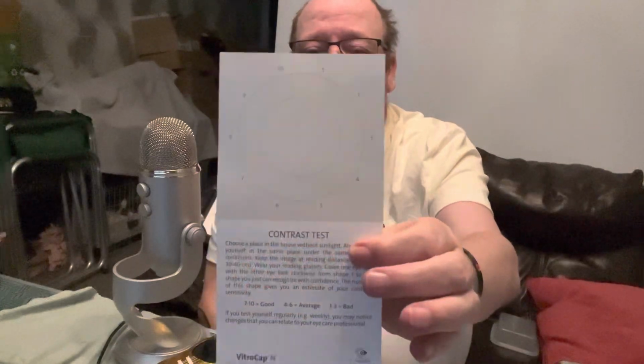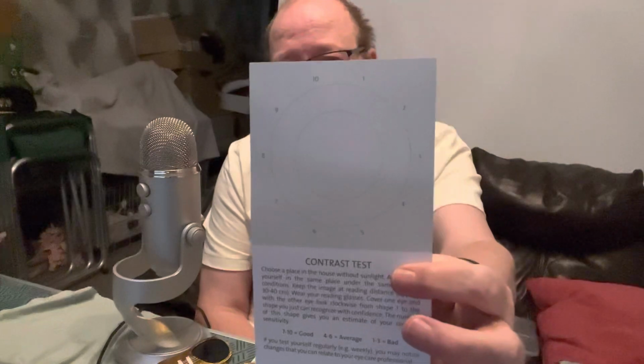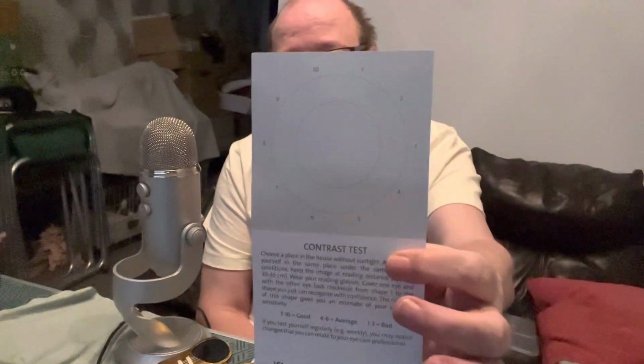There is also a contrast test. Now the contrast test has different shapes by each number, and the aim is that, again, you would be looking at that and mentioning what you see. So I would say, right, number one, I've got a triangle, number two is a square, three is a plus sign, four is a love heart, five is a circle. And in this lighting, that's starting to get a little bit more difficult, but that's how it works.